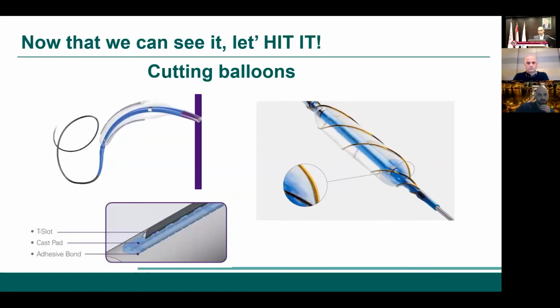Now, we saw calcium on OCT and IVUS. Probably you should use the modality you're more comfortable with for three things: acquiring the image, interpreting the image, and reacting to the image. Each one has advantages and disadvantages in some places. An ostial lesion may be better in one, stent failure is better in the other. And ideally, again, acquisition, interpretation, reaction, and what you can see and are able to interpret and react to. So let's hit our calcium. First thing, specialty balloons. You mentioned OPN earlier, which I did not include, but these high-pressure balloons, you can take them, crank more.